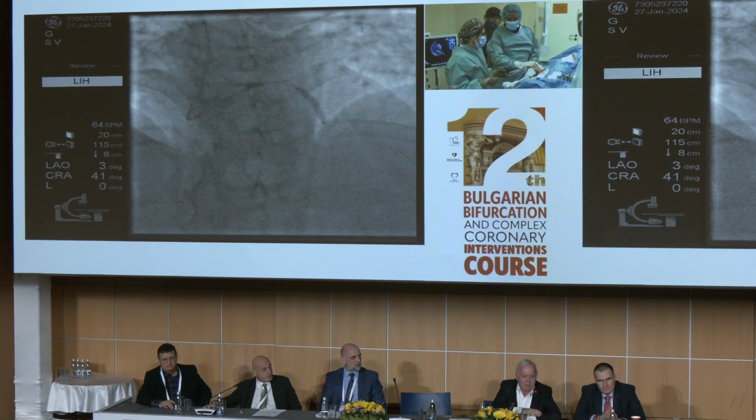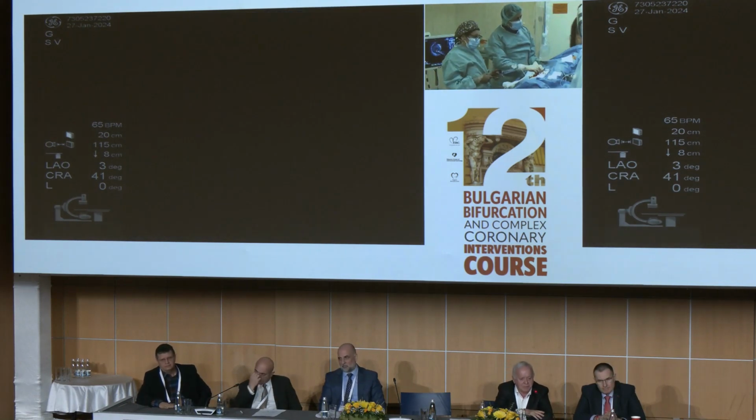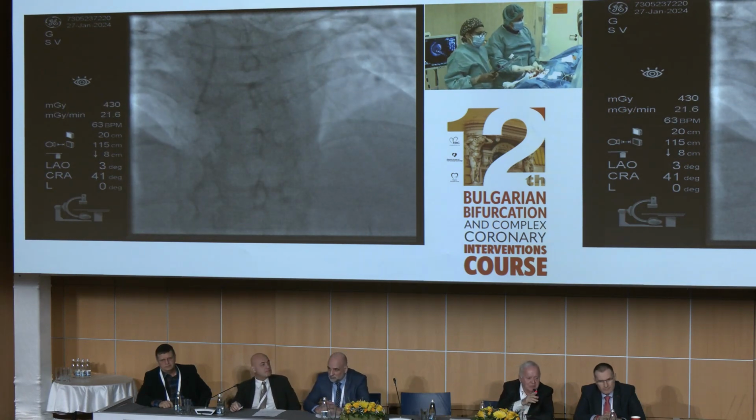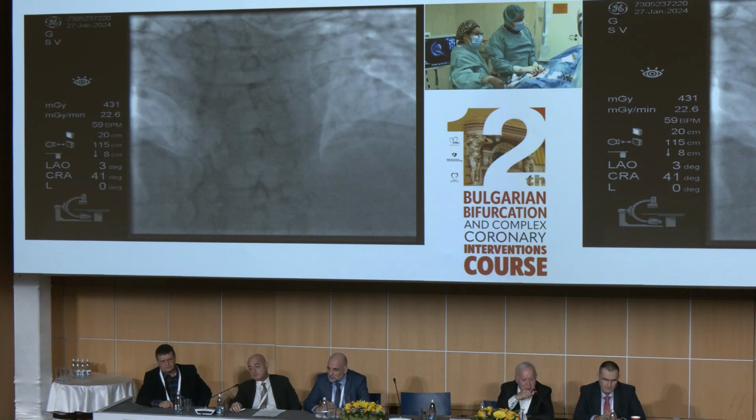Okay, this is the one second timer. So, second inflation is done for 30 seconds. 30 seconds again. Can you go back? Go back.